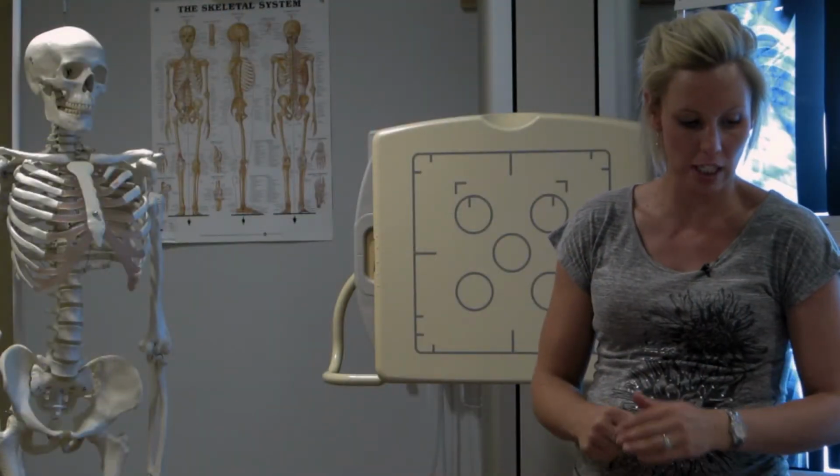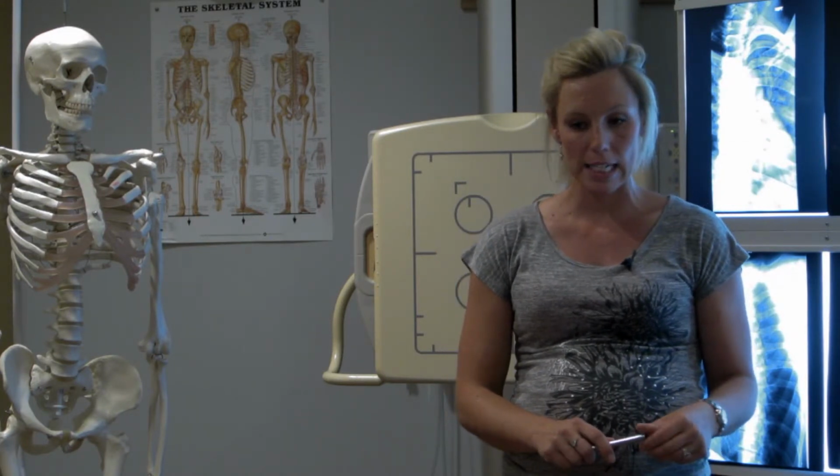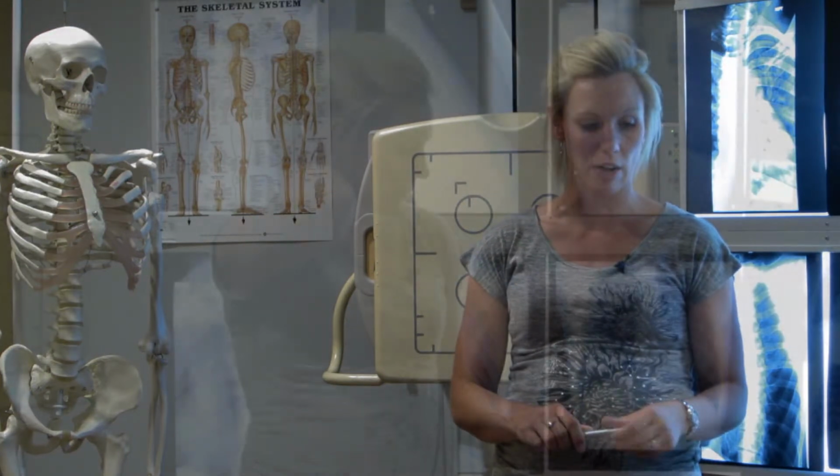So just reviewing the differences. Variation in positioning, upright versus recumbent: upright for uppers, recumbent for lowers. Breathing instructions: inspiration for your uppers, expiration for your lowers. Techniques: lower technique, 65 to 70 on your uppers, 70 to 80 when they're laying down. Artifacts, we talked a little bit about. Breast tissue is really probably the biggest one.